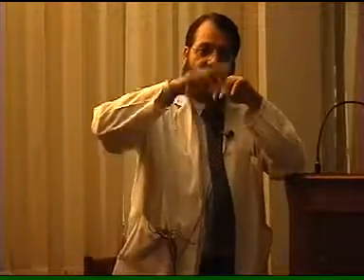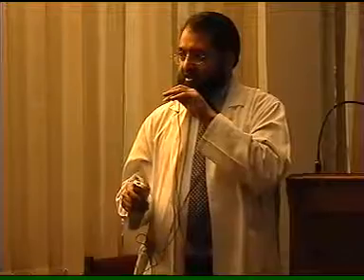This and this, they are equally distant, not like atrial fibrillation. In atrial fibrillation, it's irregular, so you cannot compute it on the basis of 2 RR intervals. You have to take a longer step, 10 seconds. Usually the modern ECG machines are equipped with a trace at the bottom, and usually that strip is from there to there, 10 seconds.